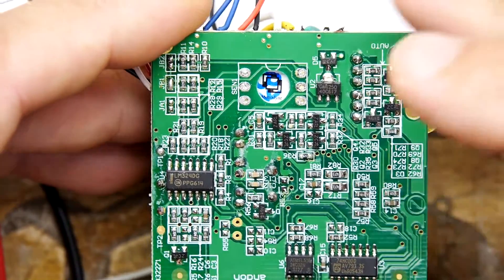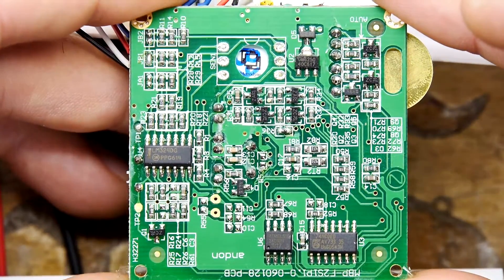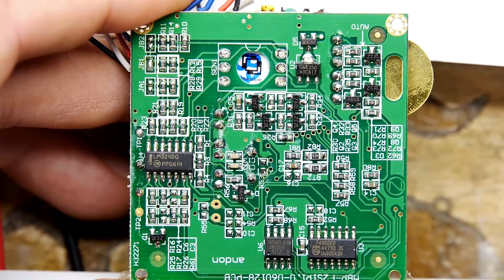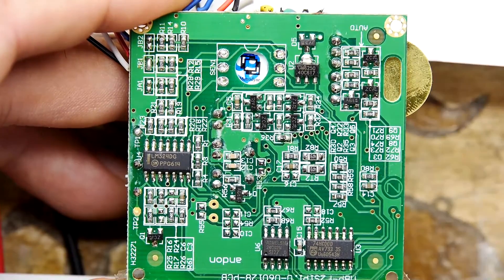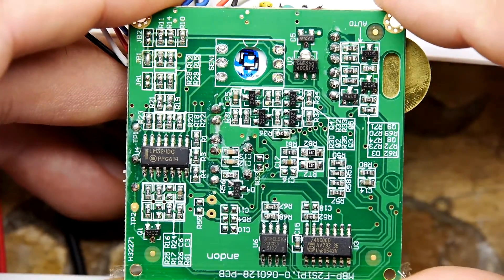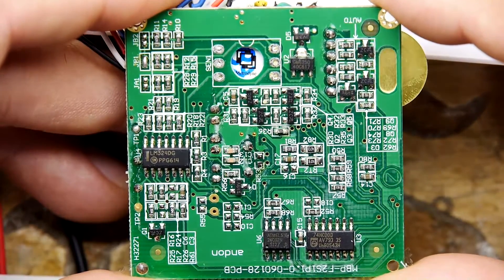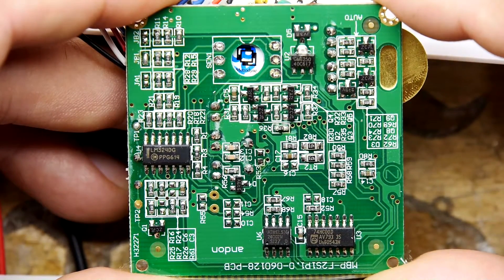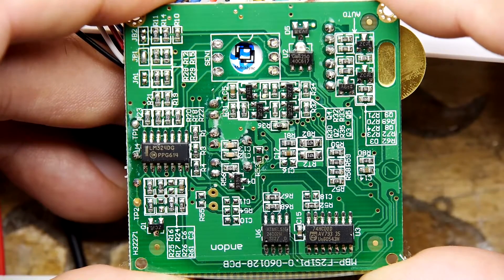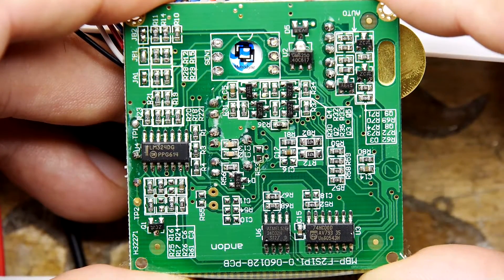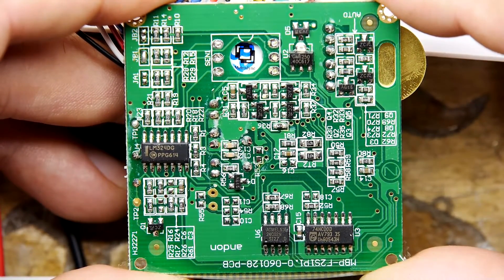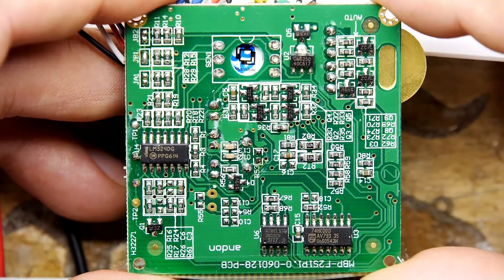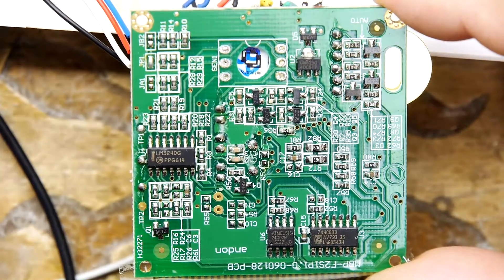So if you look on a board, if you get anything like this, what you want to do is study it and study it and look for the nomenclature that has like an F. I'm going to tilt it slightly to me. It might be less viewable for you at home. I'm trying to look at the board as well as we speak. Because if you can find one that says like an F1, F2, F3, those are normally fuses. And there'll be a surface mount fuse. And there's every possibility that you could fix that if you find it.